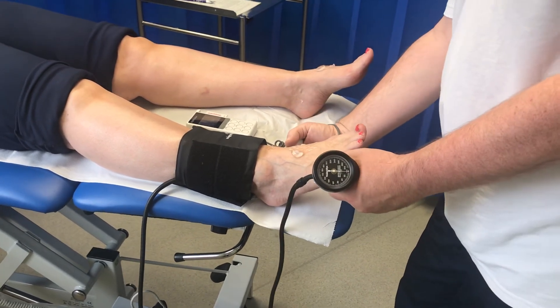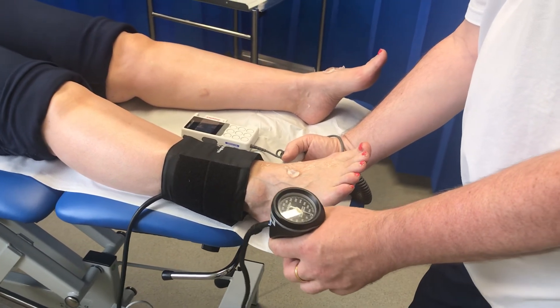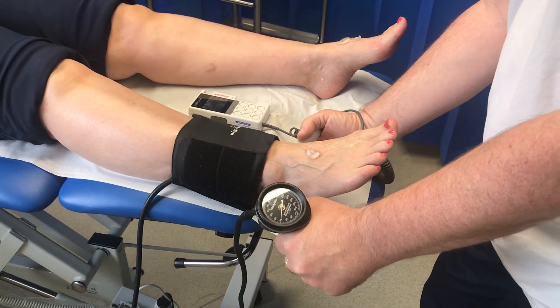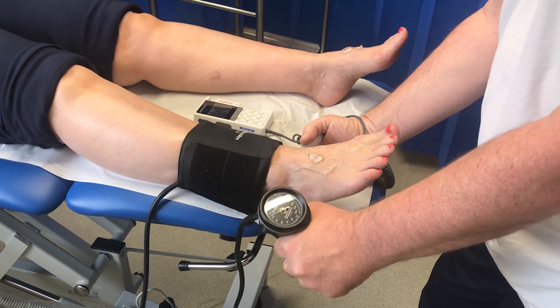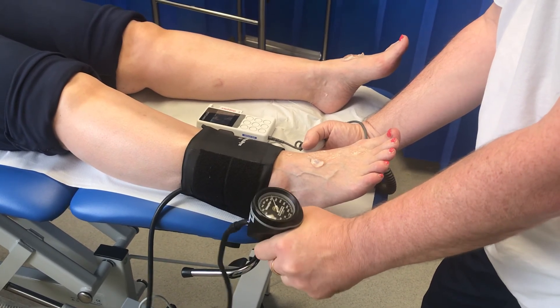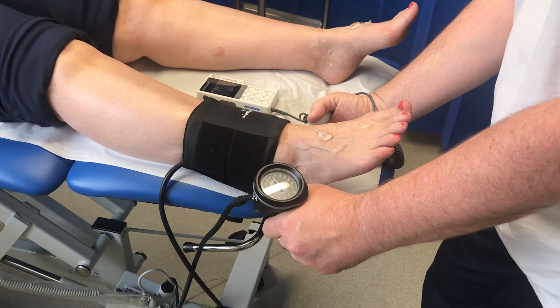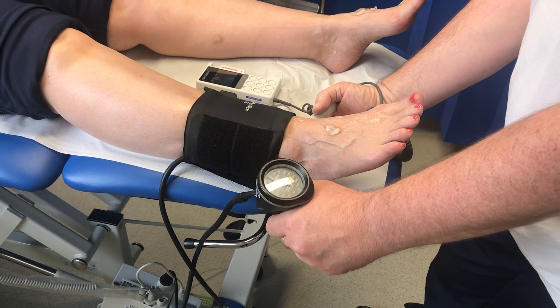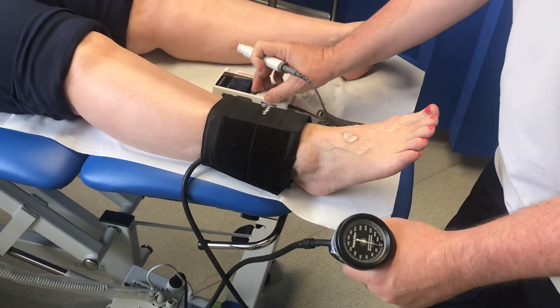I'll now move on to the posterior tibial pulse behind the ankle — same principle. Find the best sound you can find and inflate up. You'll notice the foot moves a bit when you inflate, which is why it's important to anchor the Doppler onto the skin so you stay on the pulse. Once the sound has completely gone, deflate slowly. There we go — first sound. Deflate completely to release all the air from the cuff.